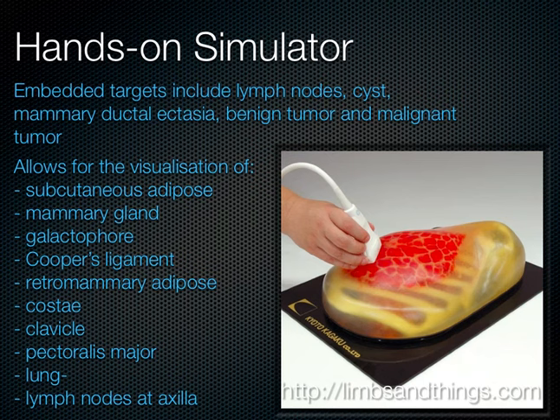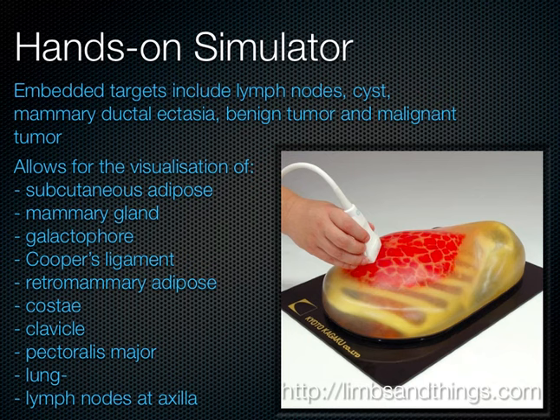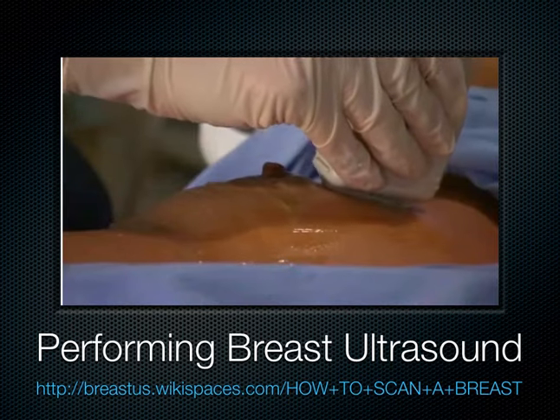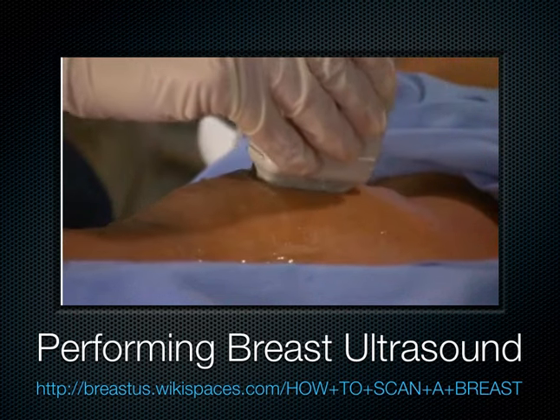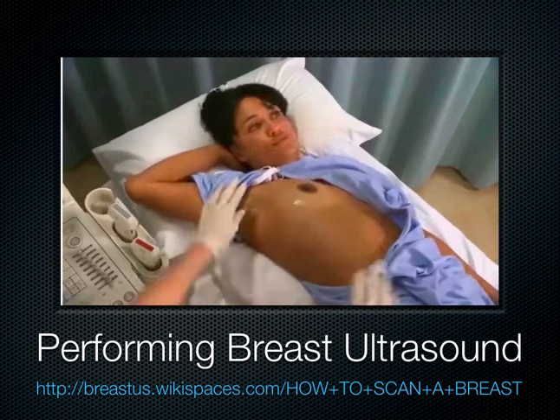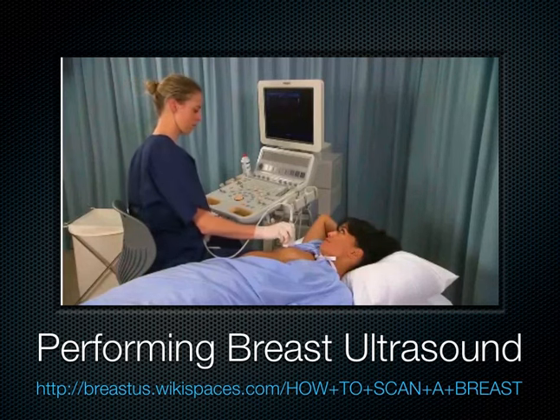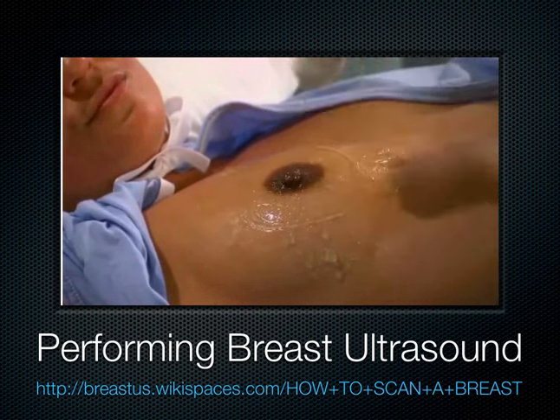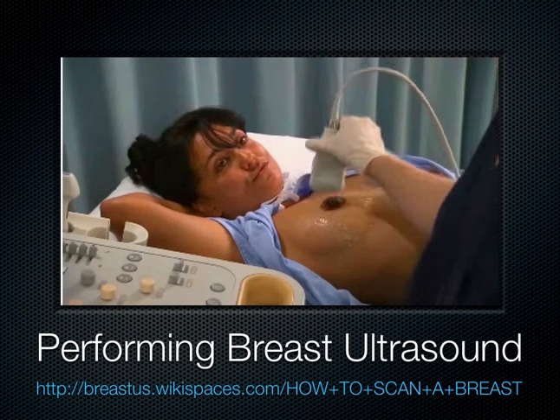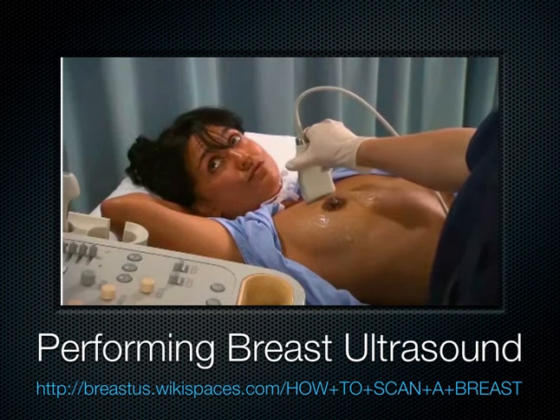The following video clips demonstrate how to perform a breast ultrasound. Scan the inner aspect or medial quadrants with the patient supine and ipsilateral arm raised above the head. Roll the patient to the supine oblique position to scan the outer aspect or lateral quadrants. Scanning in the radial and anti-radial planes is exclusive to breast ultrasound — the radial imaging plane is arranged in a wagon wheel pattern with the nipple at the center, parallel to the ductal system and extremely useful for detecting ductal lesions. The anti-radial plane is oriented 90 degrees to the radial plane.